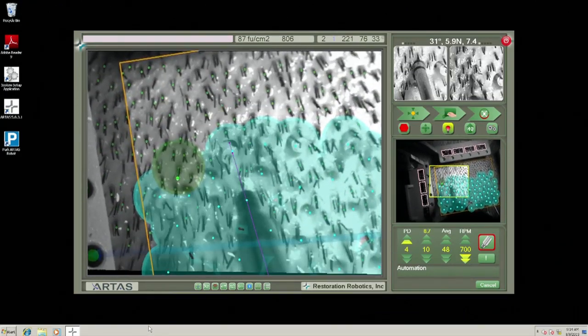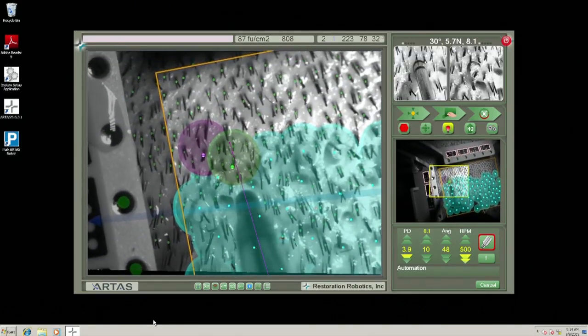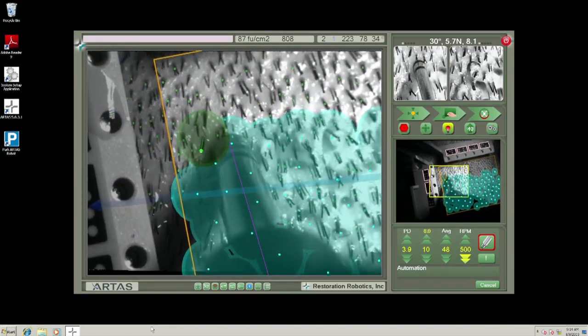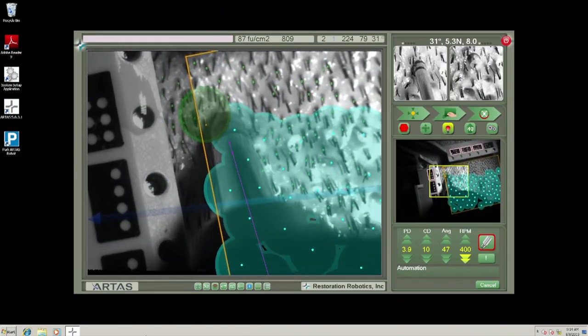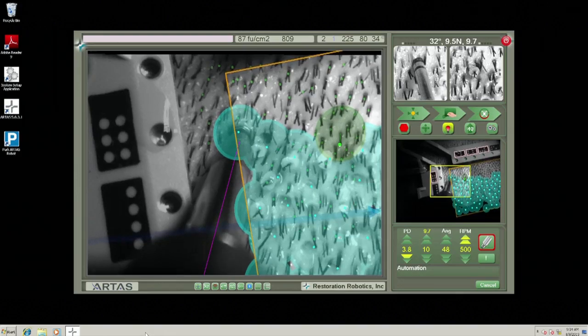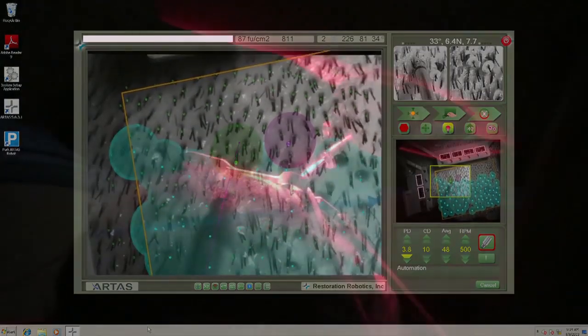Number two, for patient safety and delivery of a good product, it's about repeatedly being able to produce those precise grafts. It's not mutually exclusive from operator fatigue; they're all sort of one and the same. So I think precision and repeated precision is going to be your best advantage.